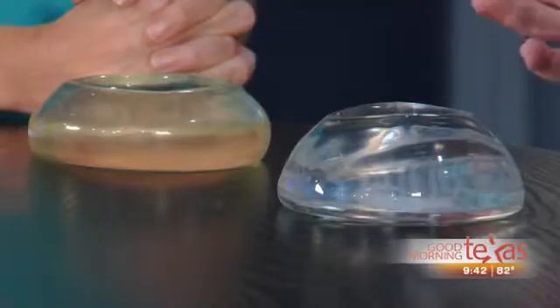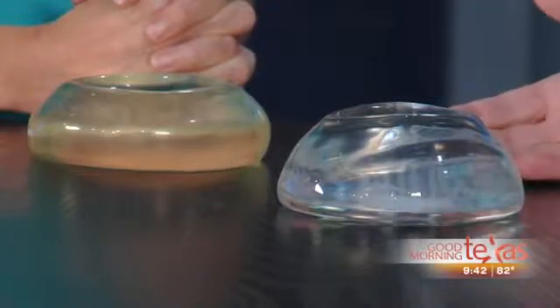Well, the new implants don't do that as much. They're called silicone gel implants. They're the form-stable implants, so they maintain their shape, they don't have that bleed, they don't cause that reaction. They came out in about 2007, so now we have a pretty good amount of time with data that shows they're about the same as saline as far as capsular contraction. So that's pretty much okay now. We can have an equal safety. The other thing that was a concern was the thought that maybe silicone implants cause autoimmune disease, cancers, medical problems. That's been negated. There's been studies that show they don't cause that anymore.